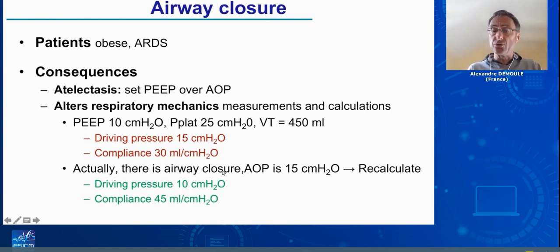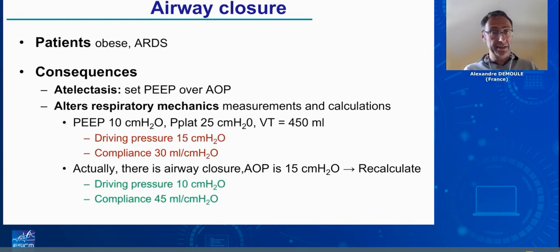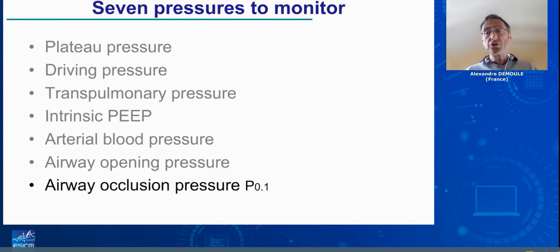But if I tell you that airway opening pressure is 15, then driving pressure is only 10 and compliance is much better than expected. The last pressure I monitor is airway occlusion pressure that we call PO1.